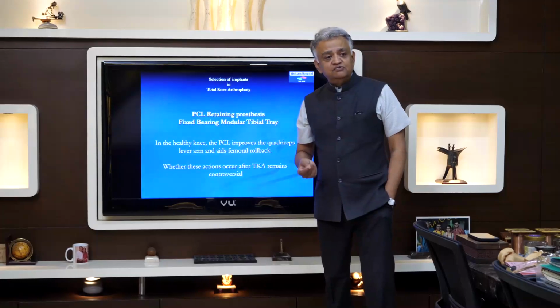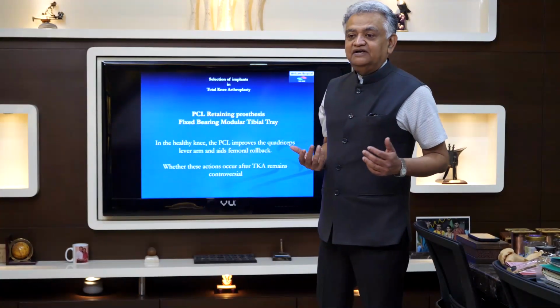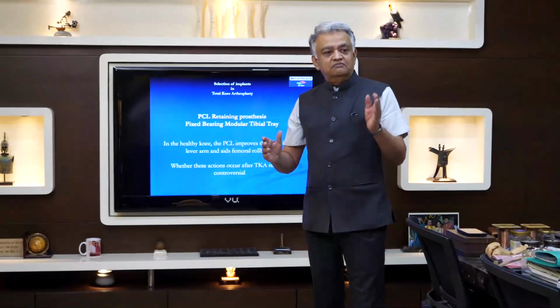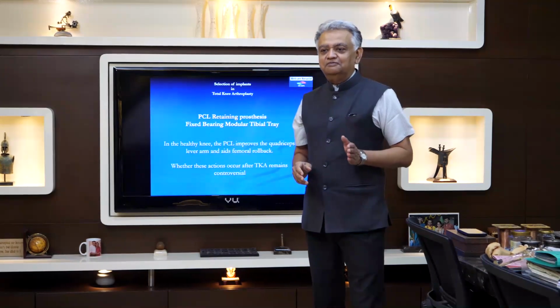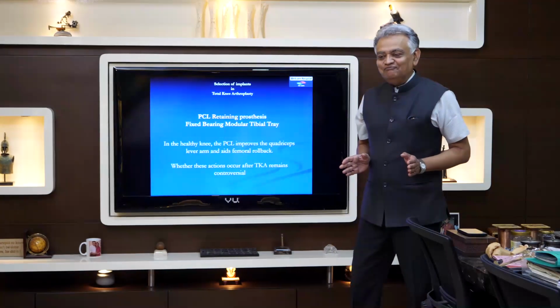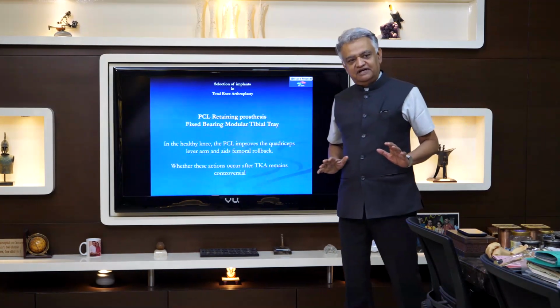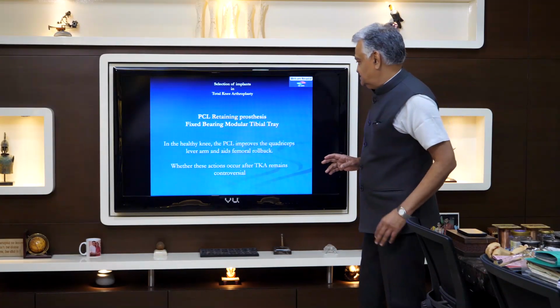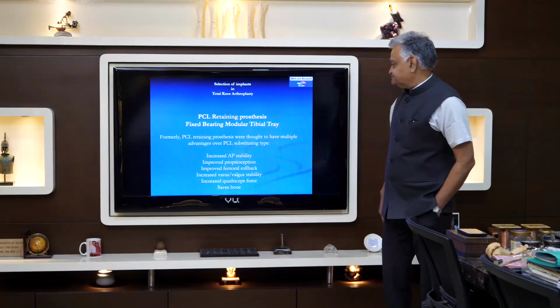So it is plain logic. But many times we scientists, if we think of ourselves as scientists, are actually highly opinionated, like members of different religious orders, in this case the religious order being PCL retainers or PCL sacrificers. To affirm that "in my hands it has worked well" is not good enough science to say that the PCL is contributing in my group of patients. Next please.